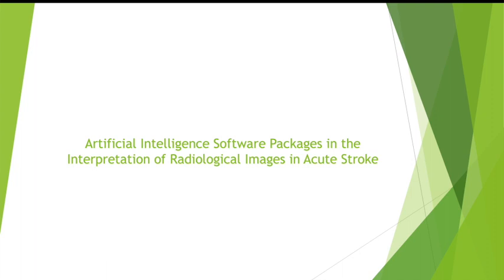Artificial intelligence is becoming increasingly more used in the interpretation of CT head, CT angiogram, CT brain perfusion studies in hyperacute stroke. Now, hyperacute stroke requires immediate management because time is brain. Every single second that passes increases the chance of the patient having disability. So this is the reason why we want rapid interpretation of the radiological images, and artificial intelligence helps with that. The artificial intelligence softwares that I'm going to be talking about in this particular presentation include Brainomix and Rapid.